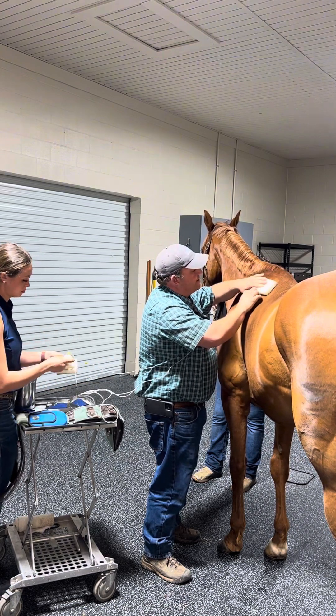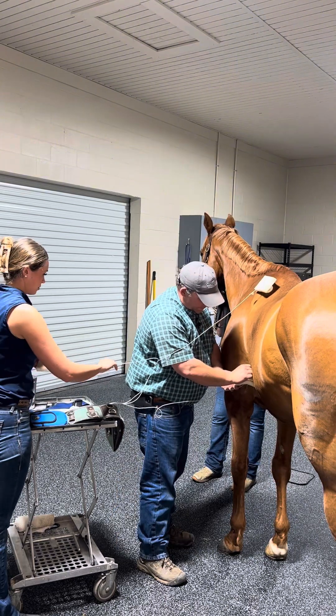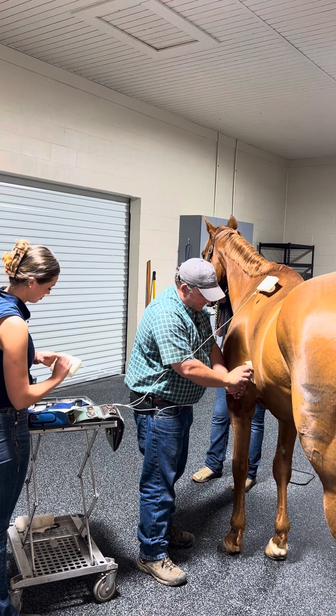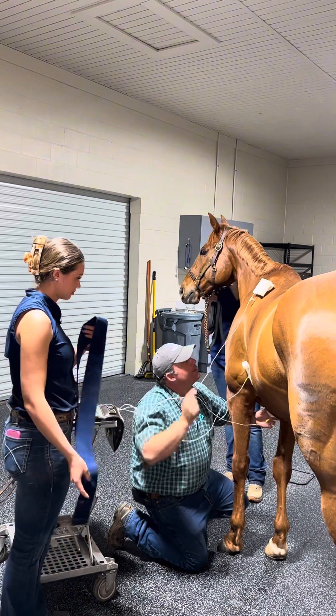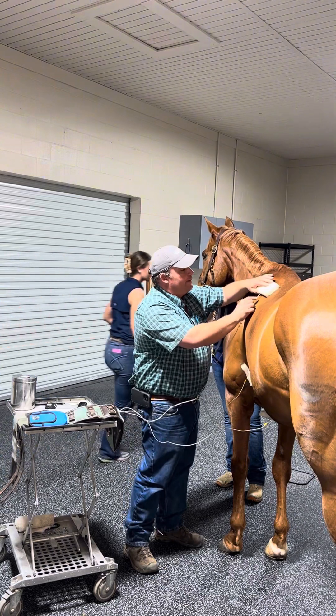You'll see what the purpose of the styrofoam is for in a moment. We've got all of our leads attached. The next part that we'll attach — we'll have to hold these in place.